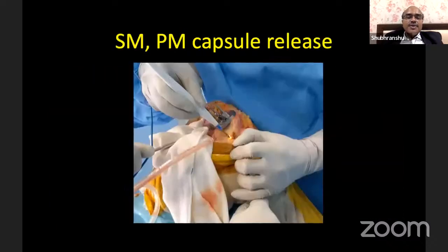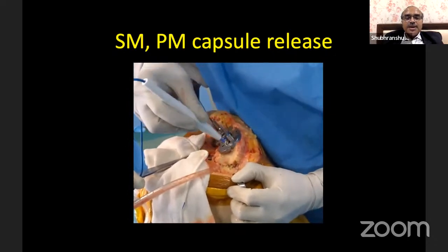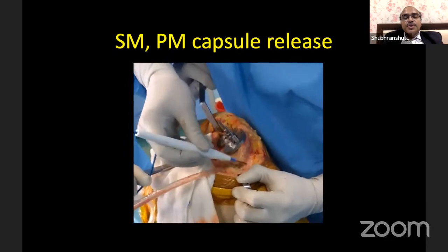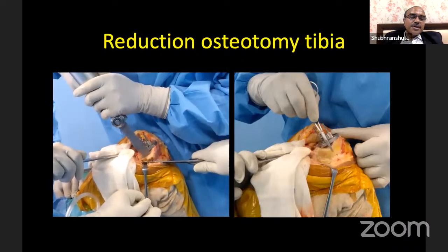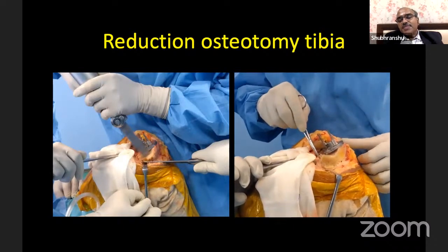Finally, now I have to do a reduction osteotomy of the tibia while preparing the tibia. So I take out the posteromedial capsule from the medial part of the tibia and go on to the posteromedial aspect and release the semimembranosus, which is attached to the superior margin of the posterior part of the medial condyle of the tibia, so that I can do a reduction osteotomy. So here we are doing a reduction osteotomy. If you do a reduction osteotomy, that also corrects the varus deformity to a certain extent. So after doing a reduction, as you can see, the defect has reduced to a greater extent, and whatever is remaining, you can build up with cement or a screw and cement.